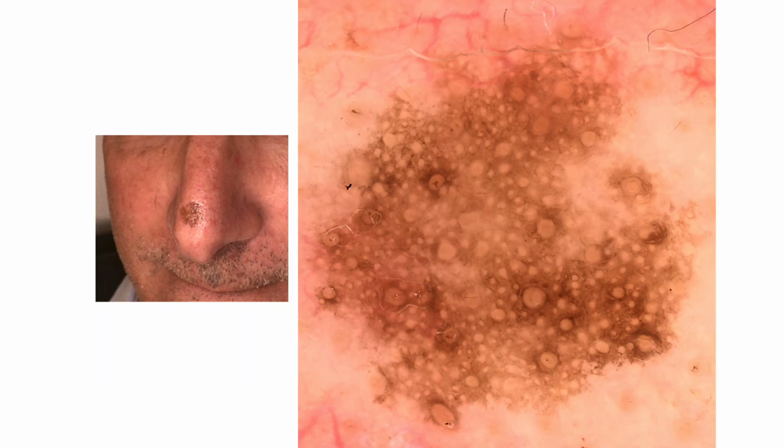And we see here the presence of a pseudoreticular pattern. The colors that we can observe the most are brown and gray. And when we see the gray color, of course, in lesions of the face, we should always be aware that there can be a problem.